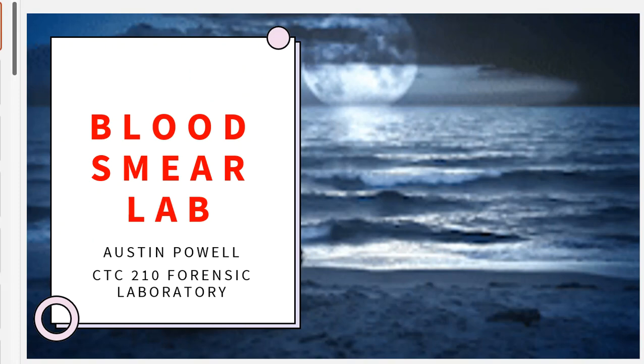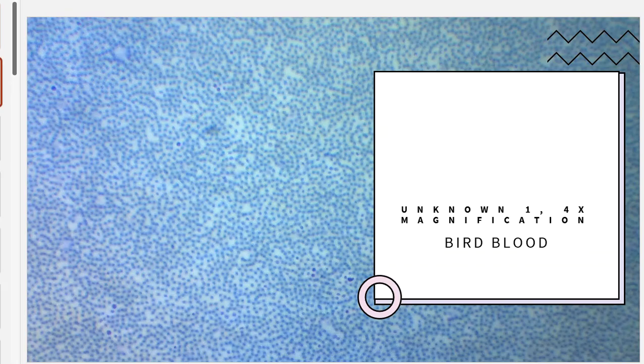As far as the presentation goes, I want you to keep in mind that we don't need anything fancy. It can just be a very blank PowerPoint with a couple images that are inserted or copy and pasted into the slide. But I really like for the slides to be dedicated to one image only, and I also like for a title to be present with that image. So here is going to be a person's presentation that they decided to upload and share with me, so that way I can see their work and make sure that they did what they were supposed to do.